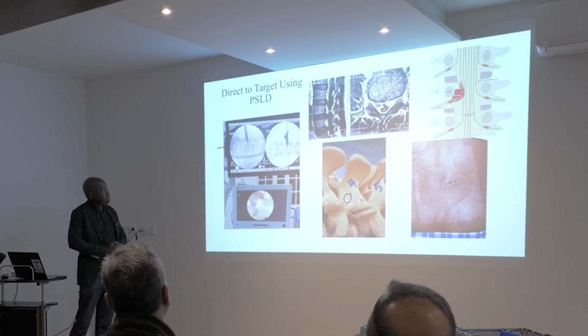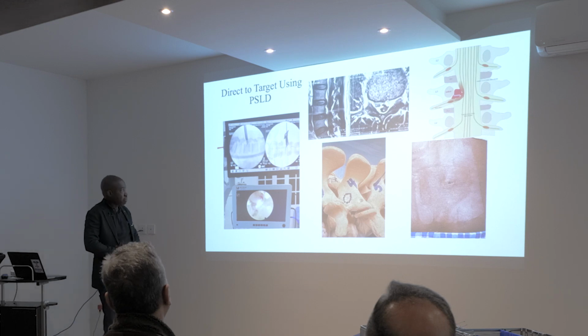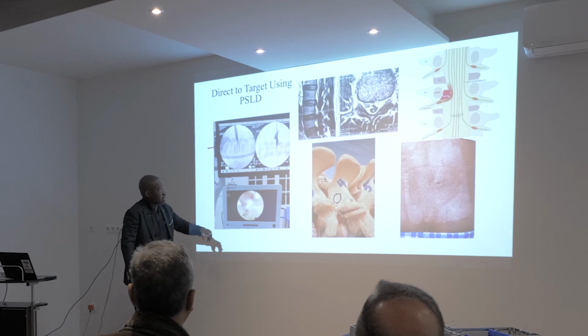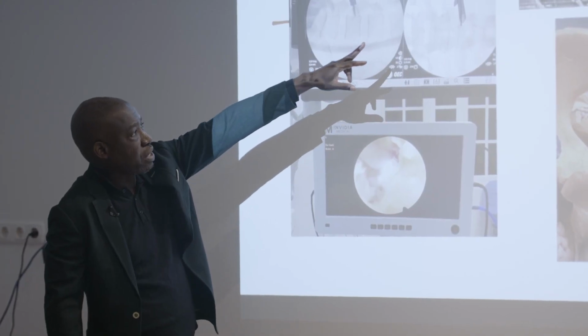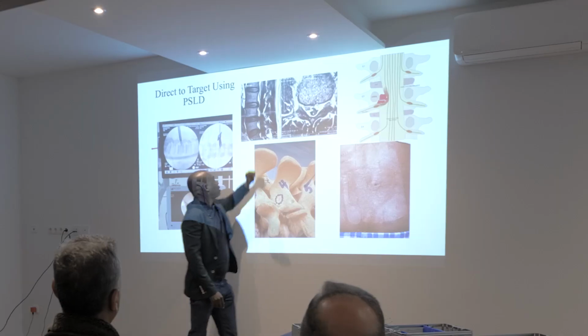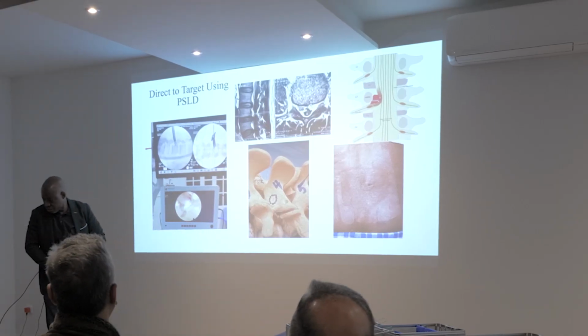And sometimes with PELD also, you can go direct to target. For example, this patient had a sequester, just a tiny piece of sequester, up-migrated.